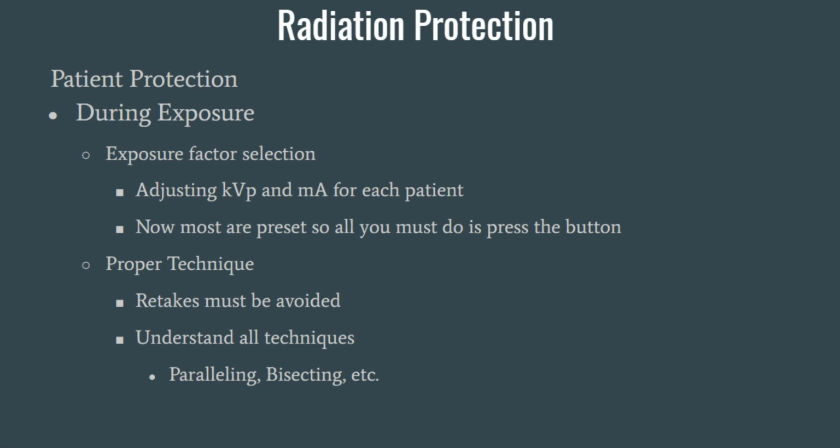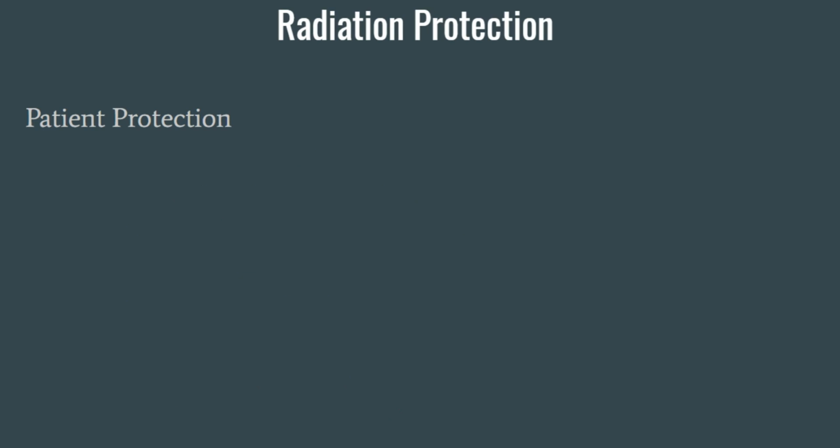And no matter what technique you're using, it definitely helps if you have a sequence to take the images. Know where you started, know what images you've already taken so you're not taking the same image twice and leaving one out. So that finishes how to protect the patient during exposure. But what about after exposure?